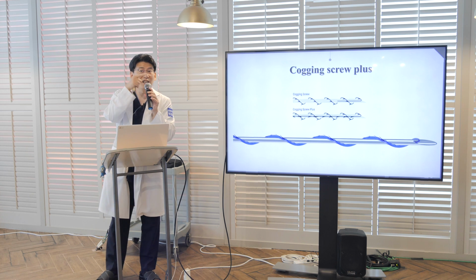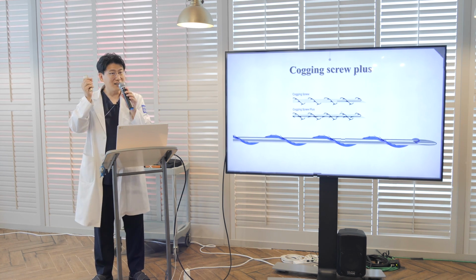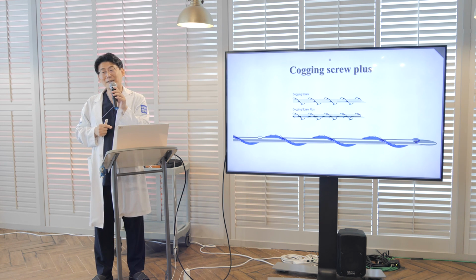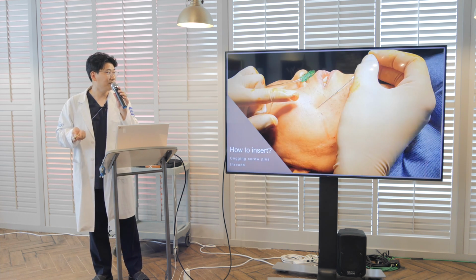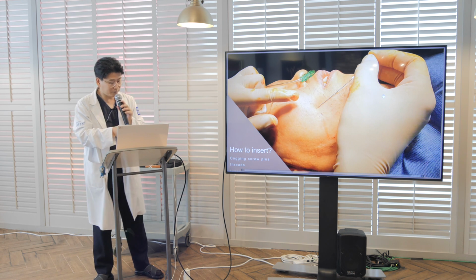This thread is 6-0, very thin. So inserting this thread is not so invasive. It's very simple, even for physicians. To insert this thread is also very simple.